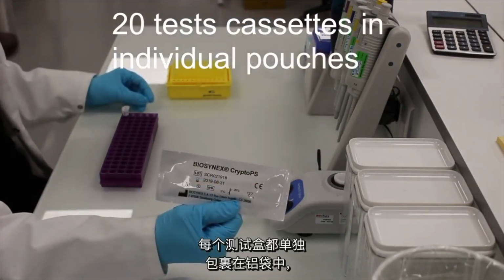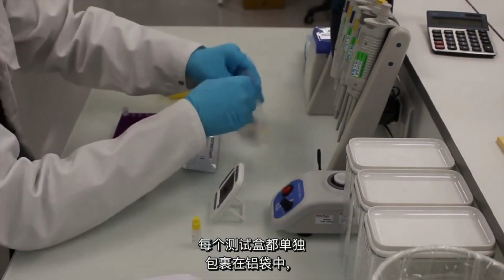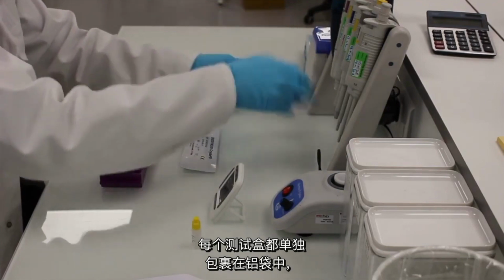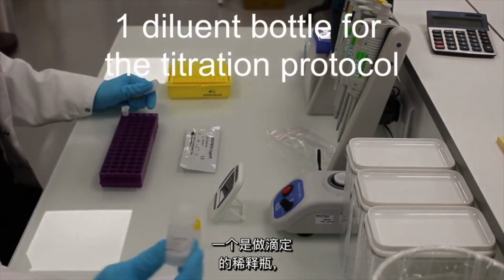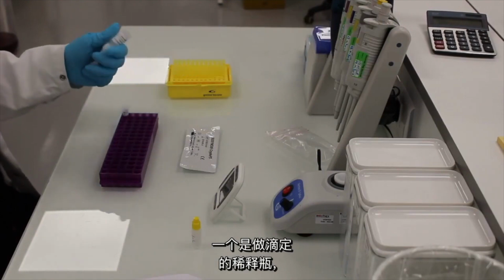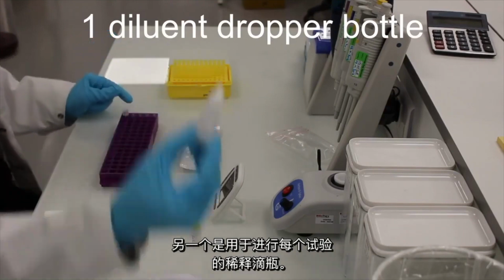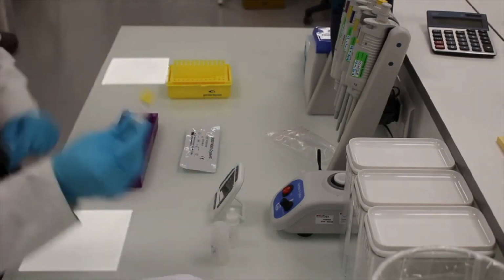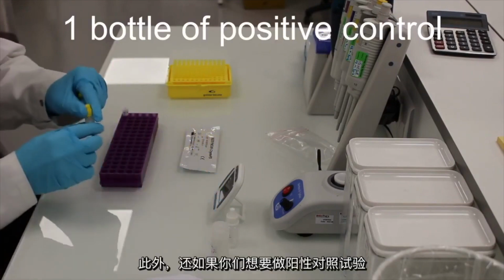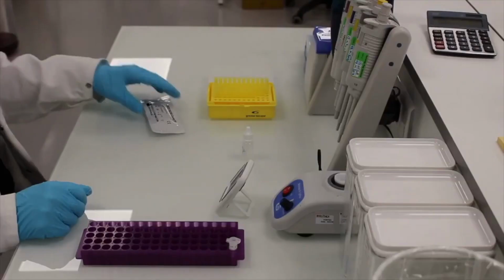Each of the cassettes is individually wrapped in an aluminium pouch. And you will find two bottles of liquid, one which is a diluent bottle for doing titrations, and the other which is the diluent dropper bottle for running each assay. And there's also a positive control bottle if you want to do a positive control to check on the results.